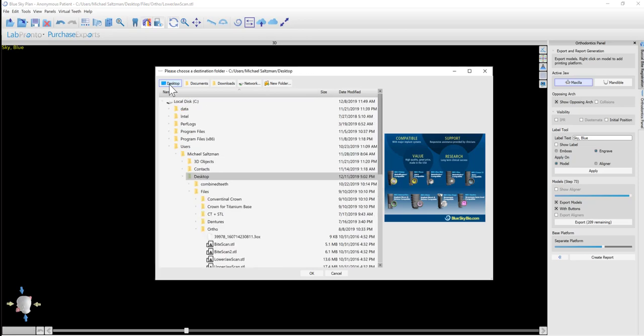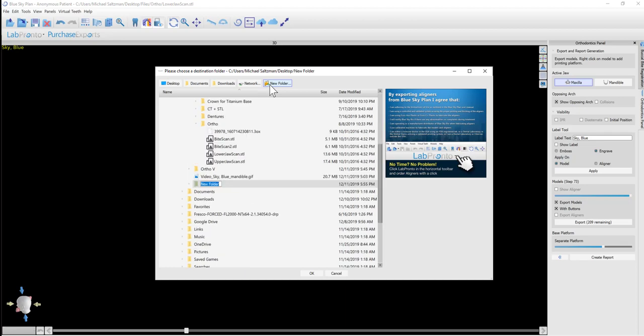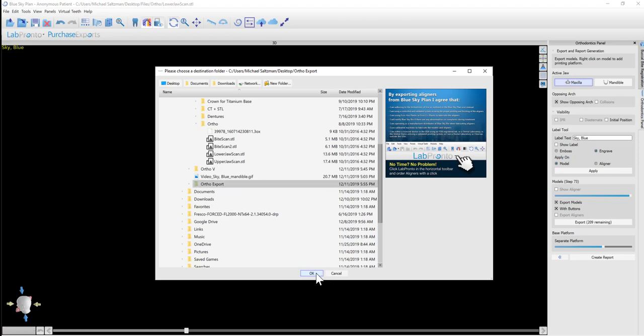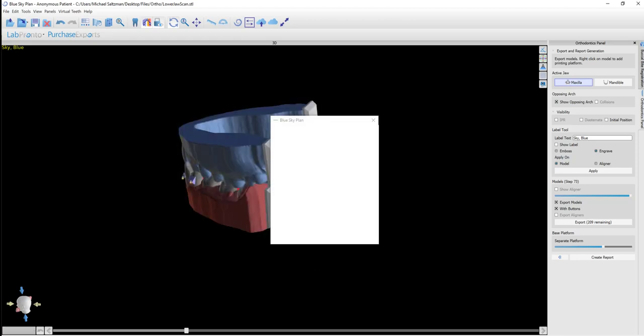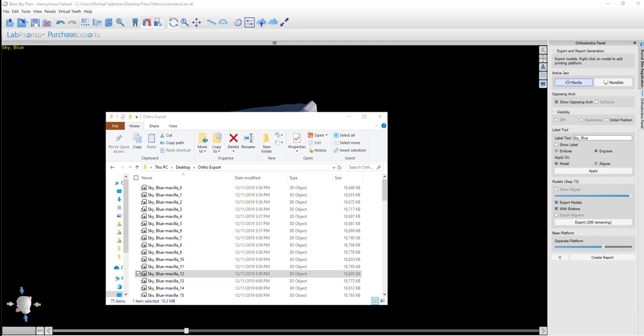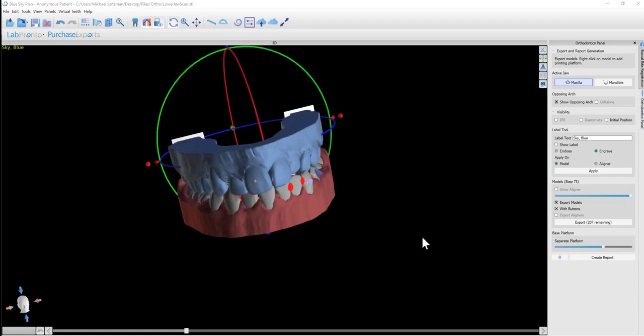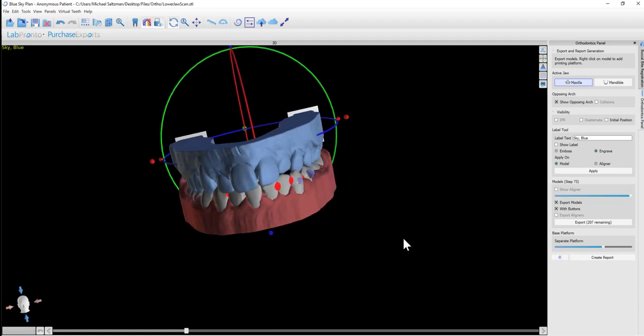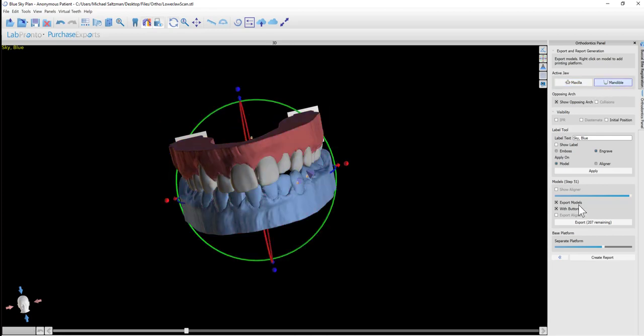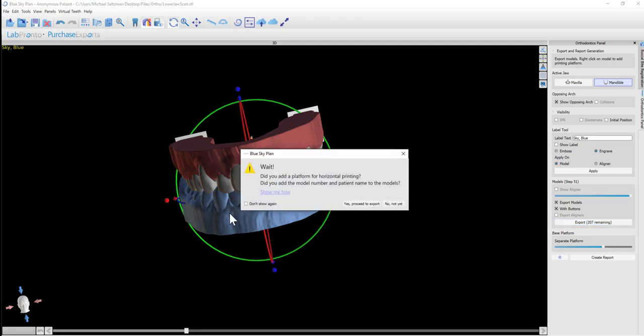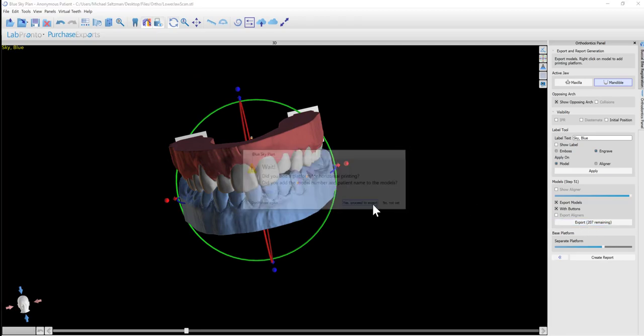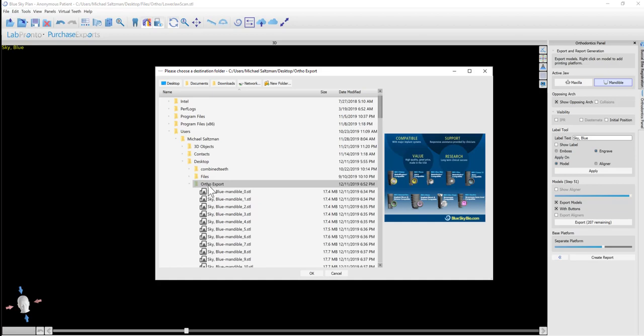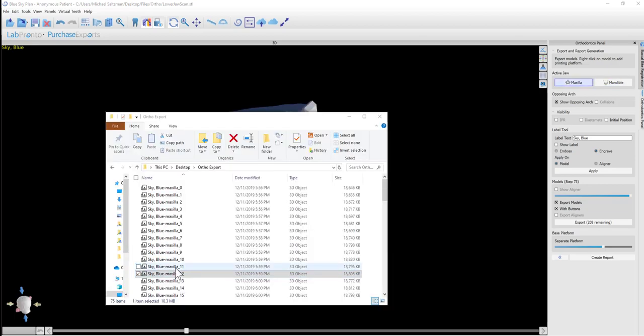The software asks us where we want to save the export. We have the shortcut buttons on the top. We could click on Desktop, and for example, I want to put it into a new folder. I'm going to click New Folder and give the folder a name just by typing and then clicking OK. Now we should repeat the export for the mandible, so we should click on Mandible, click Export, select the desired folder, and then click OK.